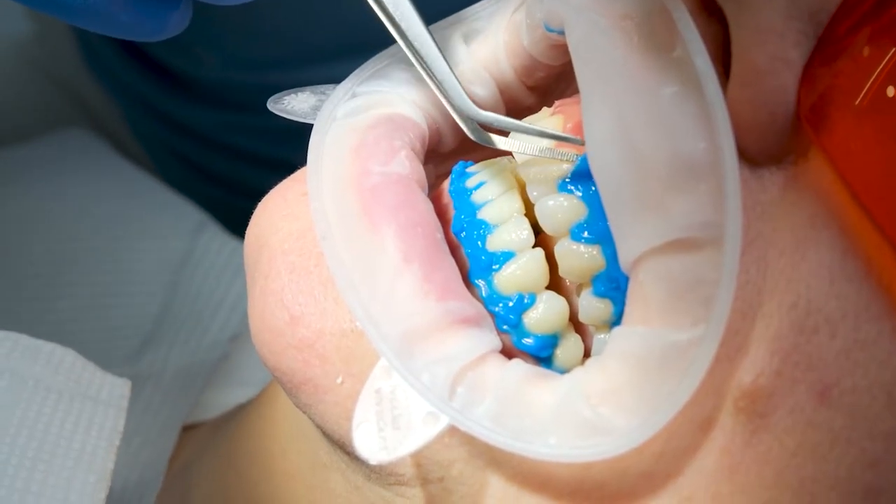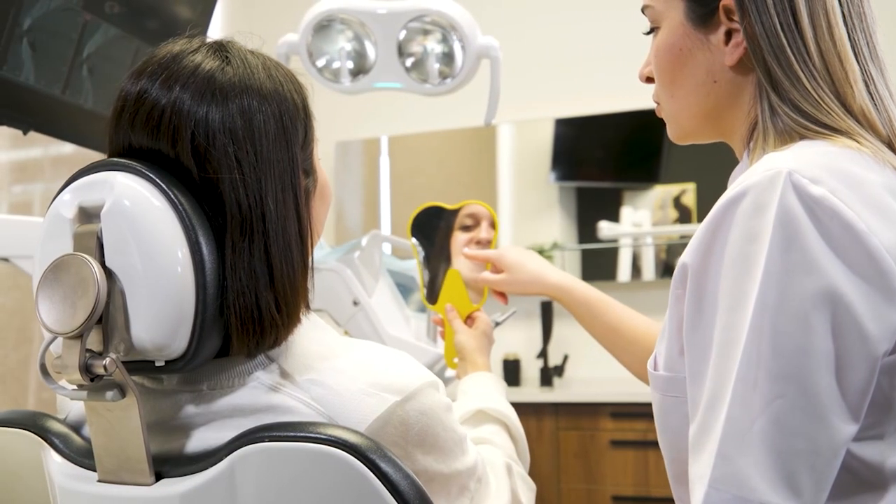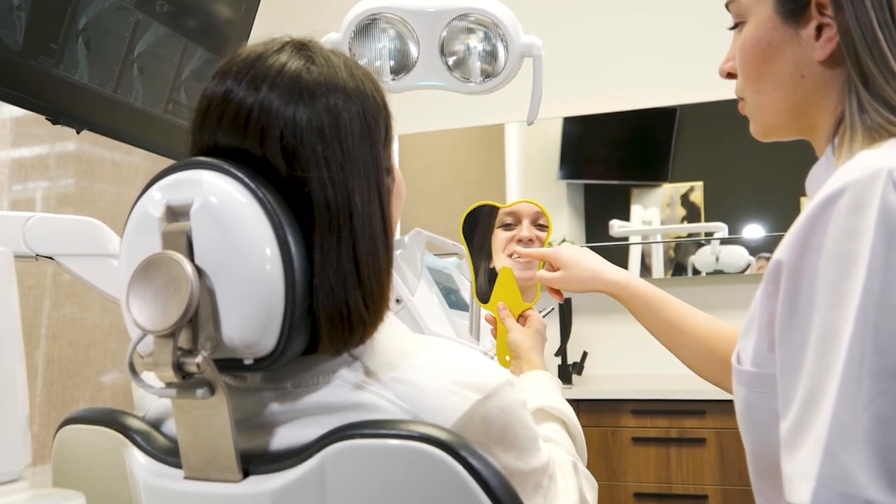After the third session, we remove the gel and we place a desensitizer to help with the post-operative sensitivity, which is usually only for the first 24 hours. Then we take pictures again, take the new shade, and show our patients the color they started with and the new color achieved with Zoom whitening.